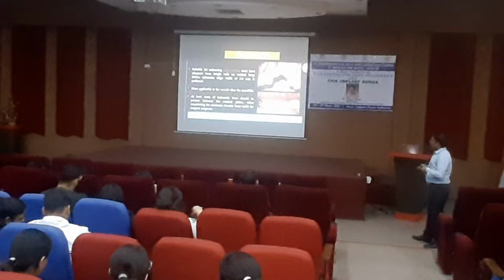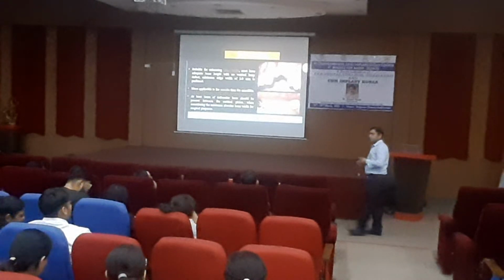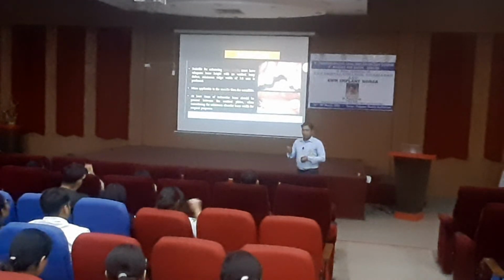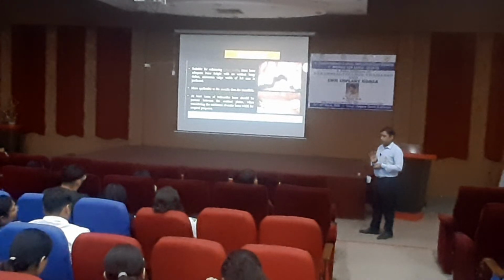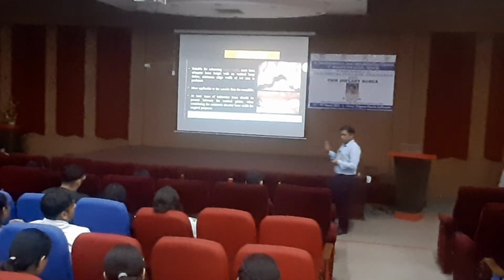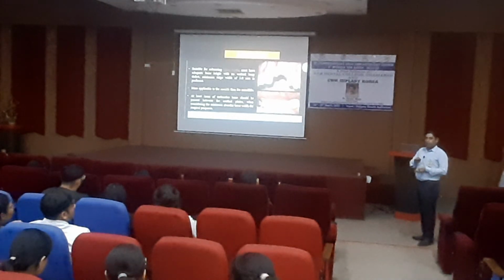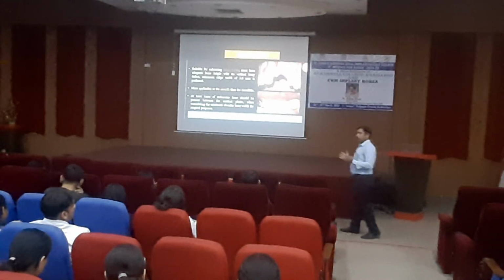Suitable for enhancing the ridge width must have adequate bone height. So ridge expansion procedure is only indicated when the horizontal width is 3 mm or less than 4 mm, but the vertical height is adequate. If the vertical height is not adequate, this procedure we are not able to do. So it is for the case in which vertical height is around 11 to 12 mm, where we can take the same implant size and only increase the width.